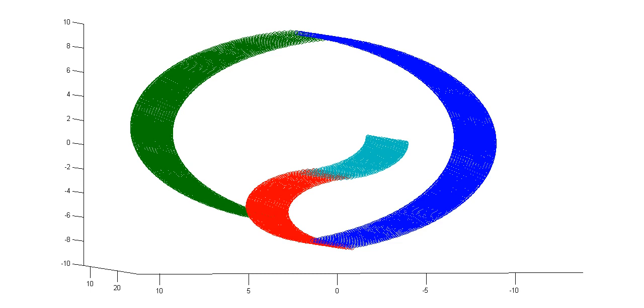But yeah, so to help counter those kinds of problems, something that you can do is incorporate priors into your data. So you might assume that nearby voxels should behave somewhat similarly. If you just see a random scattering of voxels that show significant differences, that might just be random. If you see many voxels in the same small region showing significant differences, then maybe you're more likely to be onto something there. This is a way that people think about it.